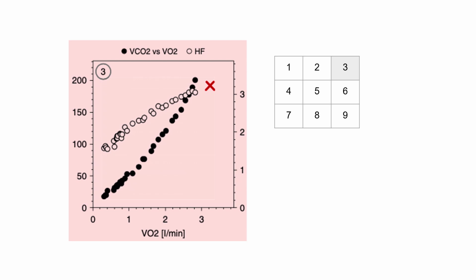Normally, the change in heart rate relative to VO2 is quite linear over the test. Changes can happen with endurance training or deconditioning. For example, someone who's undergone endurance training tends to have a shallower slope compared to those who are less fit. And this is because they're able to increase their VO2 without having to increase their heart rate that much. Whereas if you're deconditioned, you primarily increase your VO2 by increasing your heart rate quite aggressively.